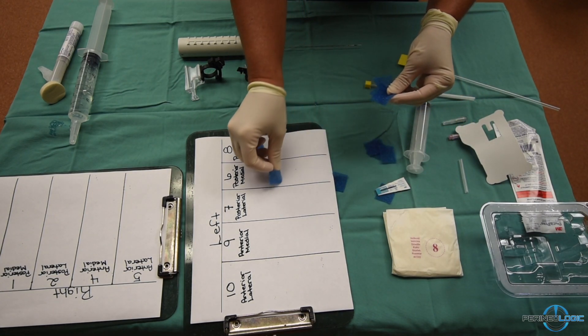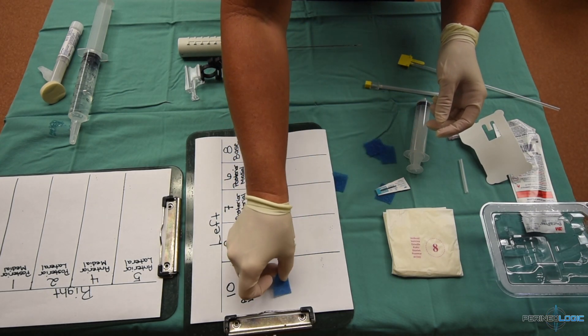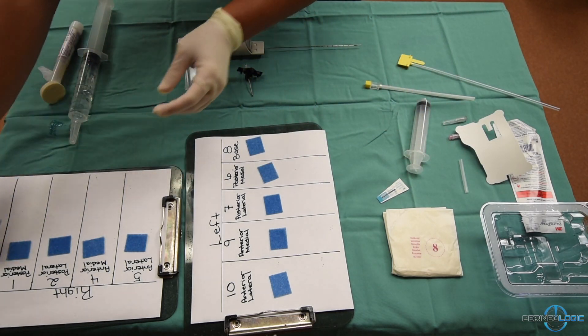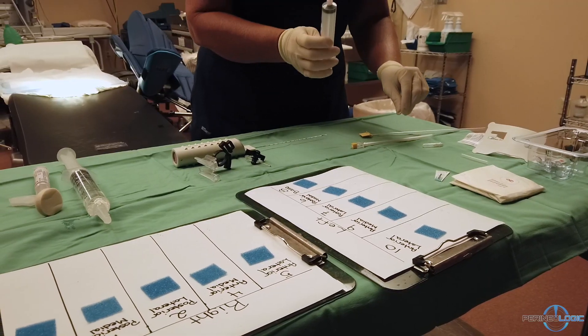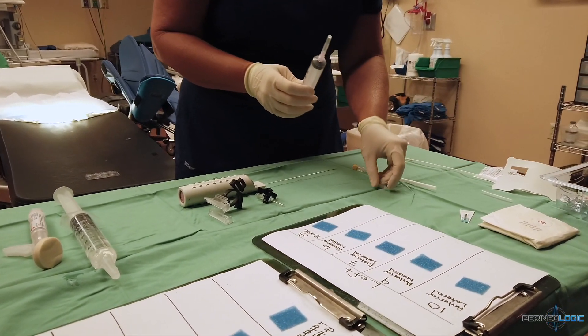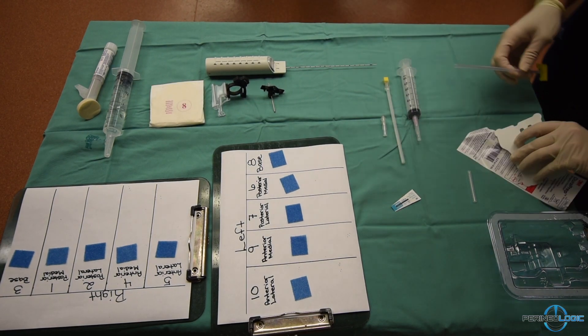Then, we place a single sponge on each of the sectors that will be biopsied. Lastly, the 18 gauge needle will be used to load 20cc of 1% lidocaine into the 30cc syringe.